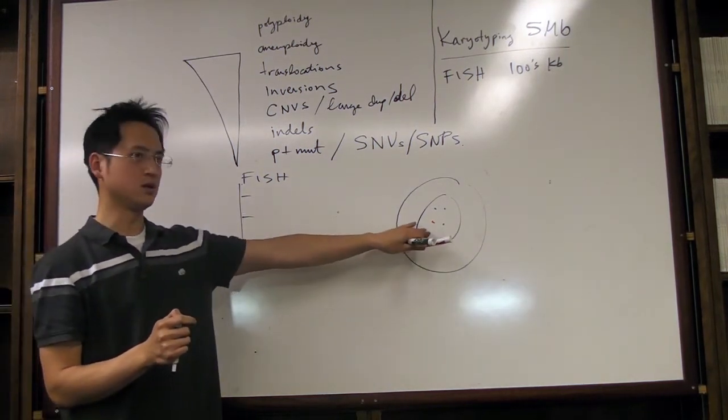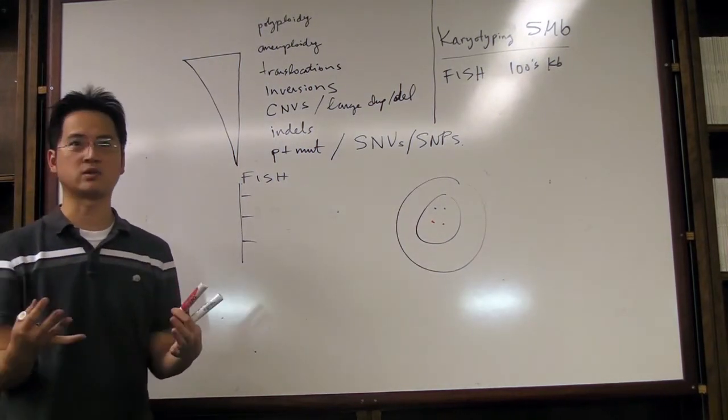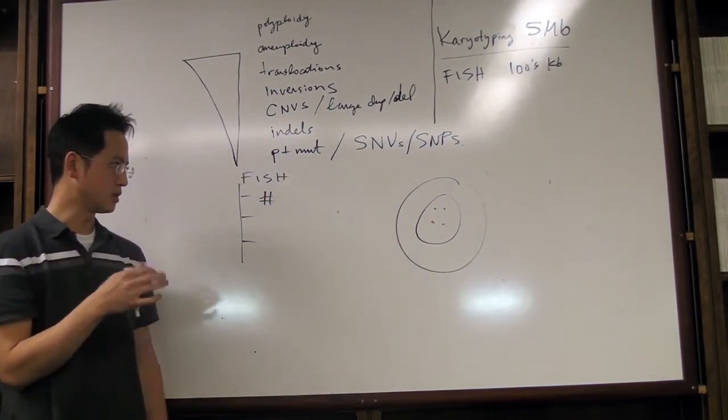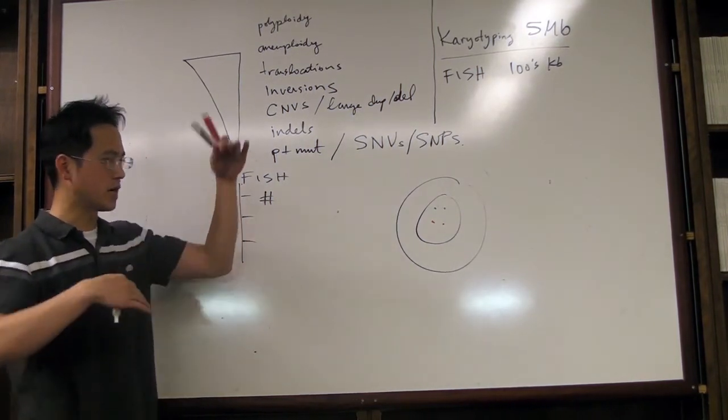Yep, so one thing, someone says gain or amplification, that's essentially enumeration, right? Counting. So you can get a number. I have 2 reds and I have 2 greens. Very basic. What's another basic thing? Location. The 2 greens are on top of the 2 reds.